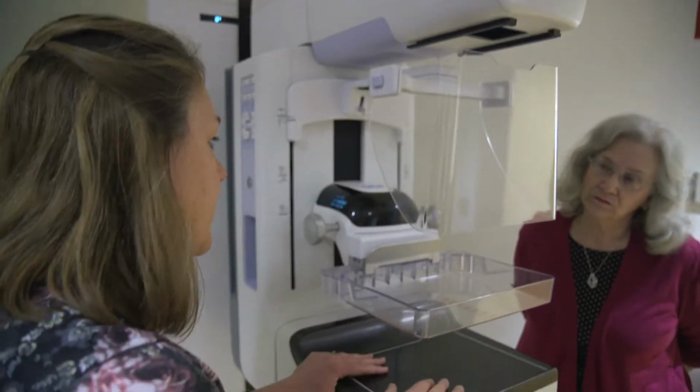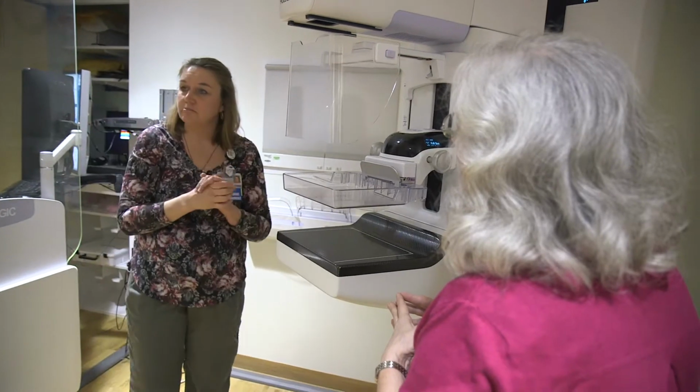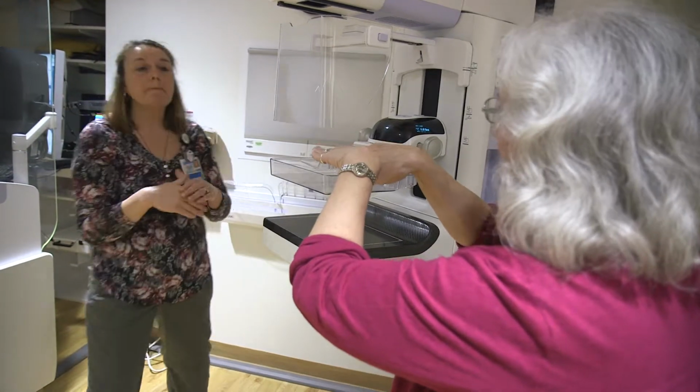As you know, a mammogram is a breast-specific X-ray that allows doctors to look for breast cancer. Before I explain how 3D mammograms work, I'd like to take a step back and briefly talk about types of breast tissue and then explain how 2D or digital mammograms work. Knowing this will make it easy to understand the difference between 3D and 2D mammograms.